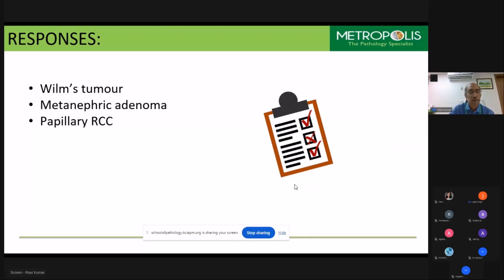So we went ahead with the IHC, and any IHCs would you suggest, Dr. Jagrati, at this point? So PAX8, WT1. Good, very good, very good. The EMA. Okay, fine.